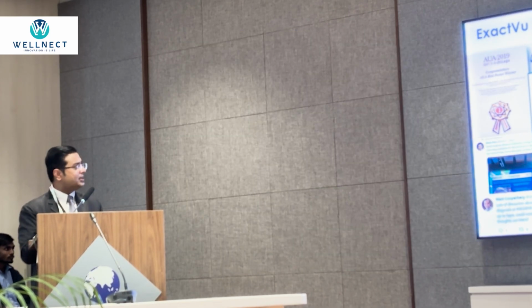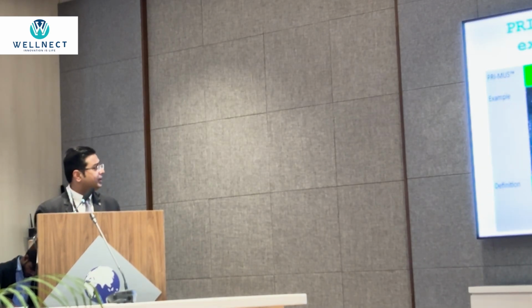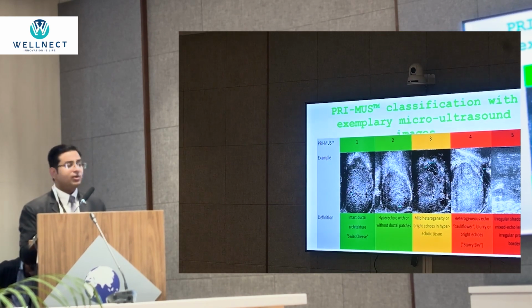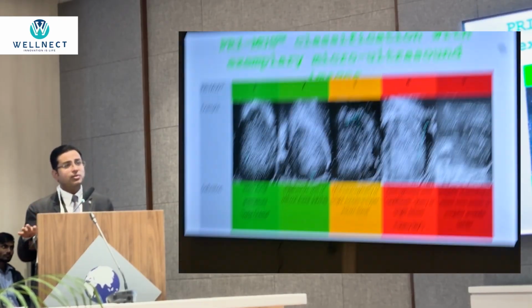About this, 60 is a little older data now. You have 75 plus peer-reviewed manuscripts in major journals, many of them in Q1 journals, and it has come into the guidelines in 2024. Now, this is the Achilles heel of micro ultrasound: understanding the grayscale patterns with reference to cancer.